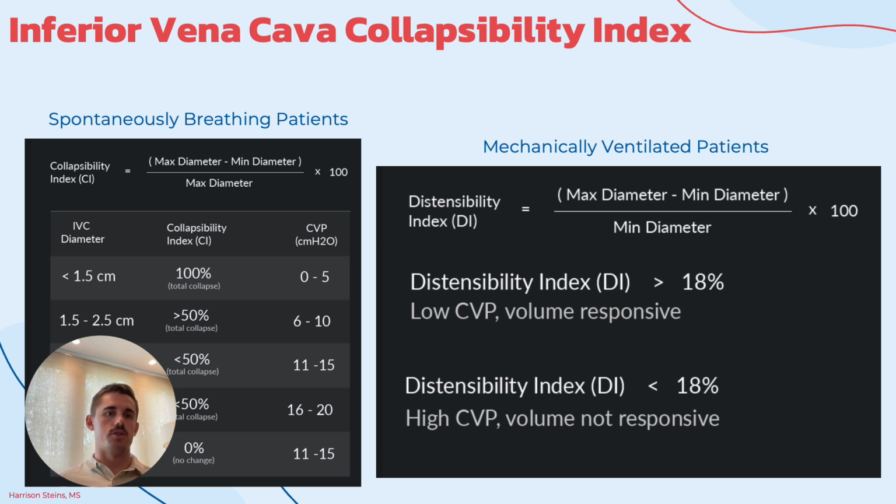You put these measurements into these calculations, which I've taken from an app called Resus.US, like resuscitation ultrasound, which is an awesome tool that I use all the time still, and I used a lot when I was first learning some of these exams.